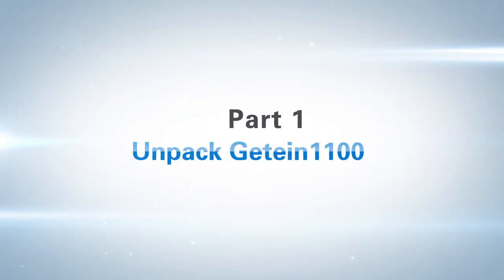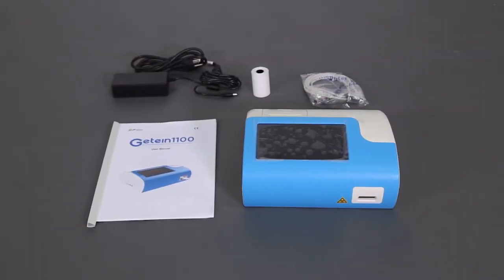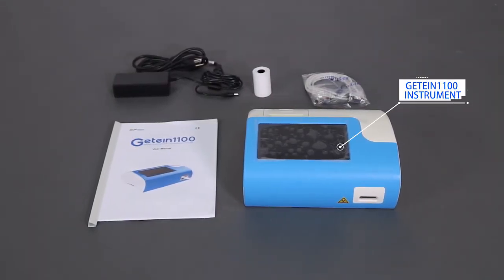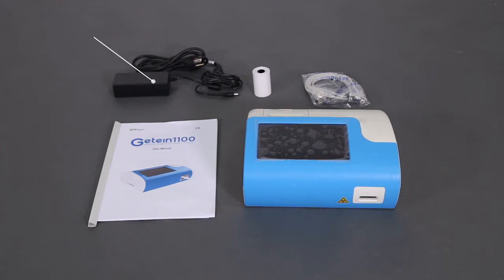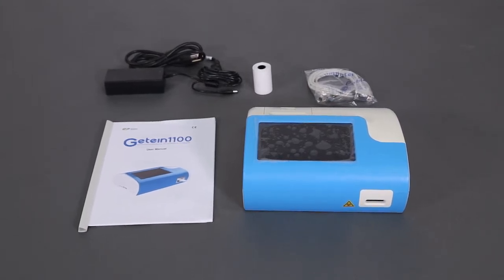Part 1: Unpack Getein 1100. The package includes the Getein 1100 instrument, a power adapter, a data cable, a user manual, a roll of printing paper, etc. Please check the items according to the packing list.